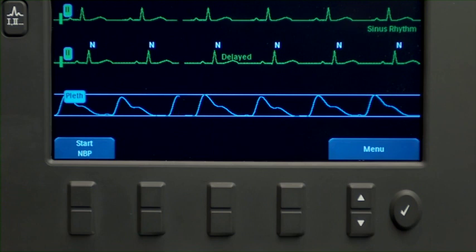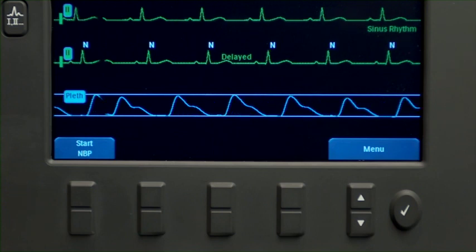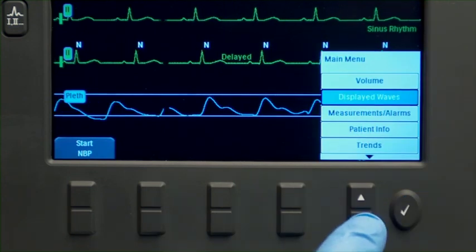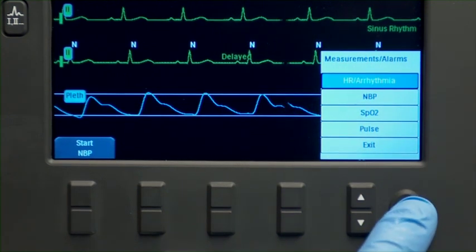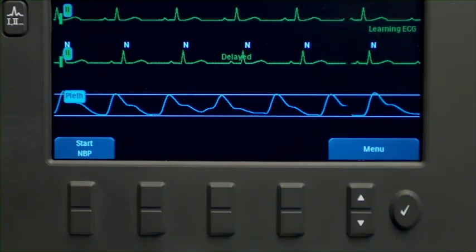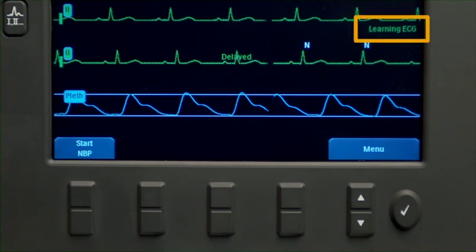If the device is not identifying the patient's rhythm correctly, you need to initiate relearning. To do this, press the Menu Select button. Navigate to Measurements, Alarms, HR Arrhythmia, Relearn Rhythm, and press Menu Select. The XL Plus will then display a message confirming that manual relearning has begun.